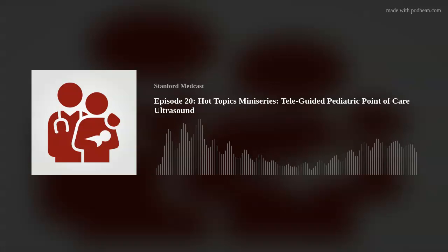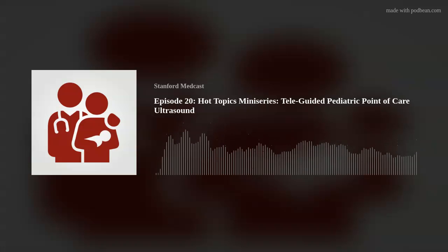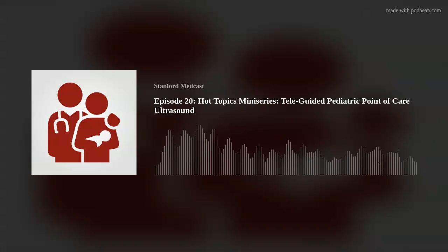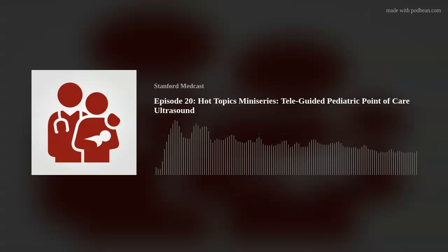And number two is lack of trained people that are able to do this procedure successfully, because you have to be fairly certain and fairly confident in your skills when you're utilizing point of care to really be able to convey that information in a format as a teacher. So you really have to master the skill yourself before you're able to pass it on. And then every platform has its own learning curve. So you have to learn it. The learner has to learn it. And so the challenges I see are those, in addition to time.